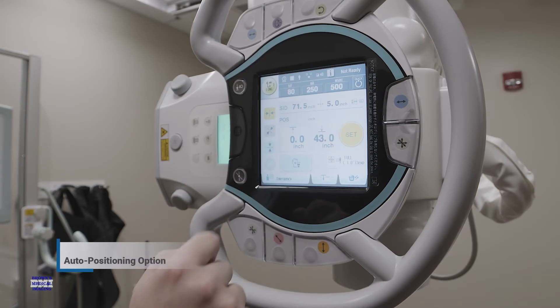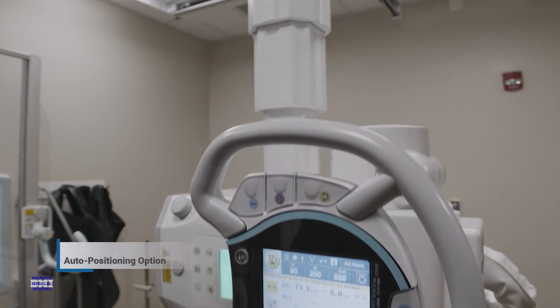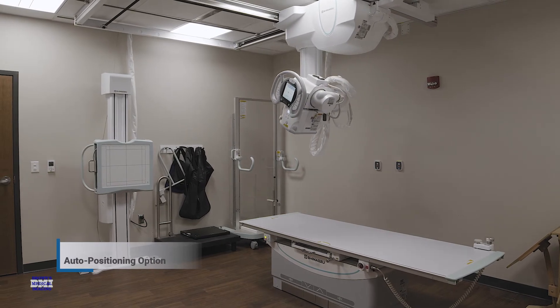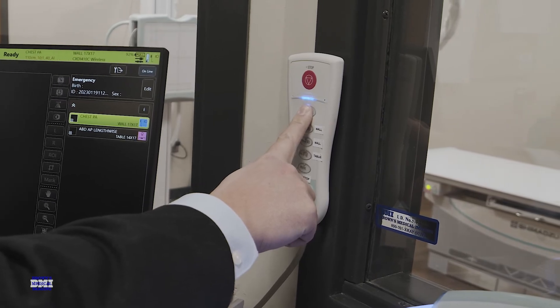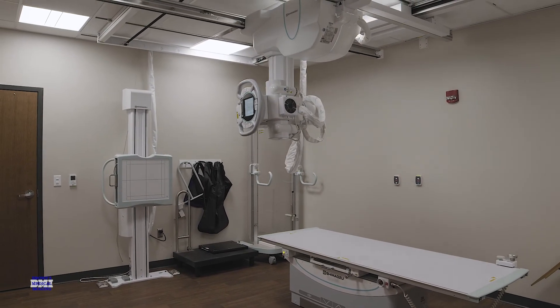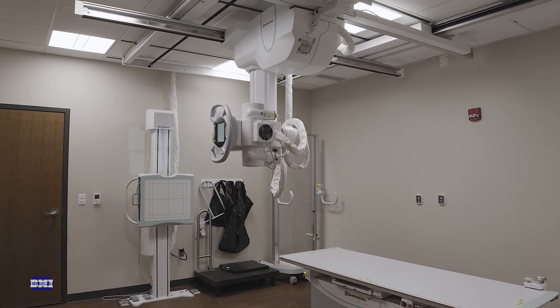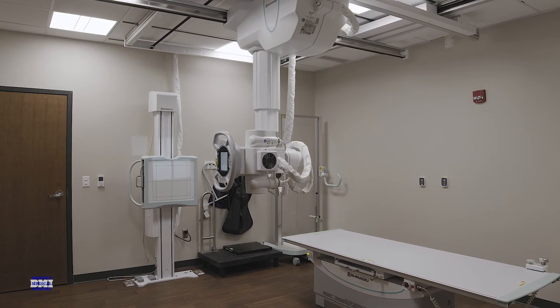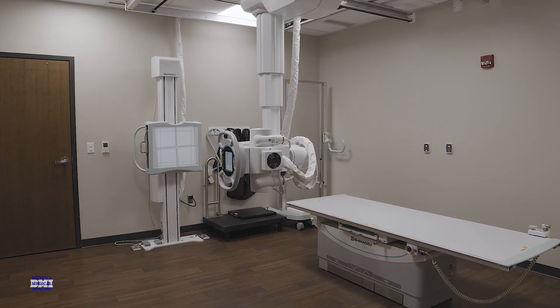The auto-positioning feature is a remarkable option that enables the x-ray tube to take up any desired position, ensuring accuracy and precision every time. The user simply needs to press one button on the remote controller and watch as the tube moves into place. This not only saves valuable time, but also leaves the operator free to focus on patient care. As an added bonus, the high-quality design of this system ensures smooth operation with no unnecessary strain or effort required.